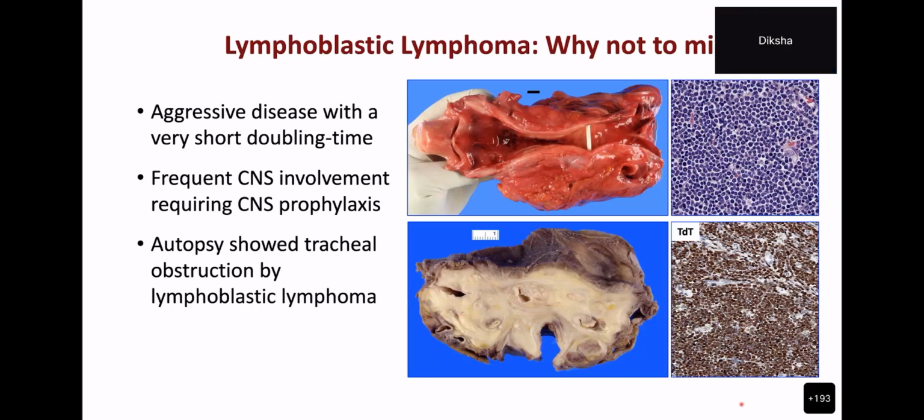Thank you, Sumit. That's very helpful. And the other thing I told you about, tapping any effusions, has helped me with multiple cases. If the patients have effusions, I usually tell them to tap the effusion and send the slides. Even if I can just see the slide and confirm that there are blasts or blastic-looking cells, it's extremely helpful because you will not have a thymoma giving you an effusion. So it's a very quick thing that, if clinically they're willing to do it, you can confirm right away.